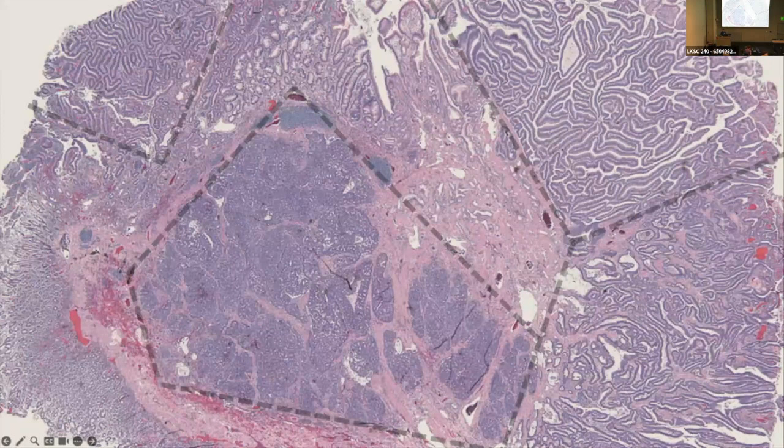Here's one. How do you QC your slide in order to be confident that your slides are fit for a multiplexed imaging study? That's a good question. For an initial first pass, you're going to get an H&E on every slide that you get, and you can usually see on that H&E whether there are really obvious artifacts that make the cells look not right.